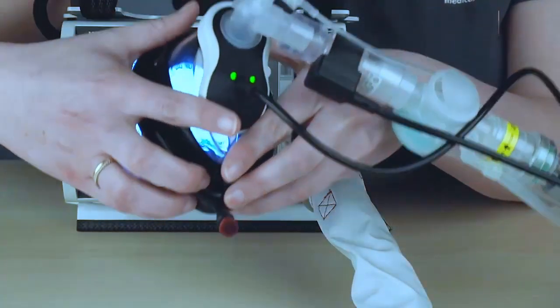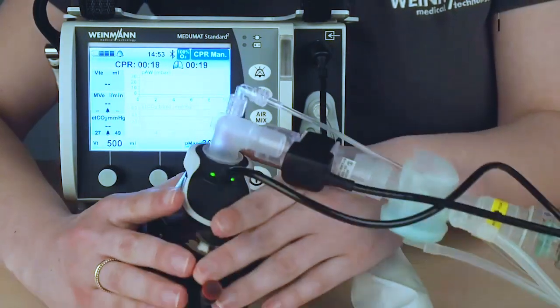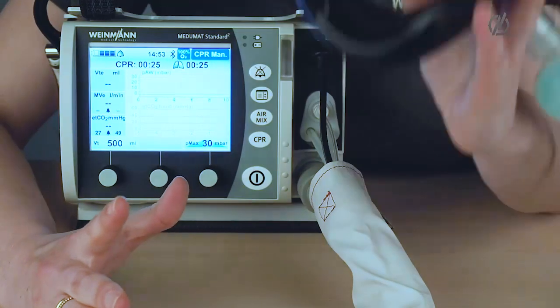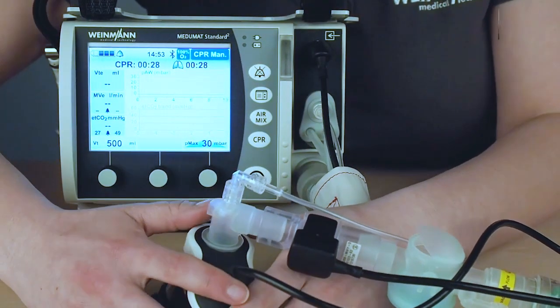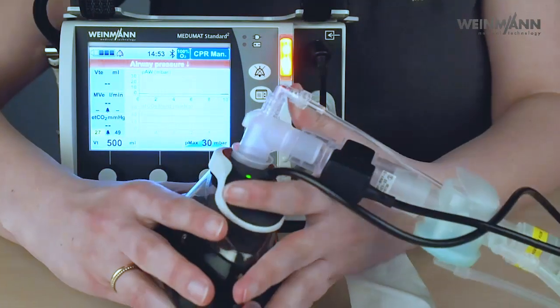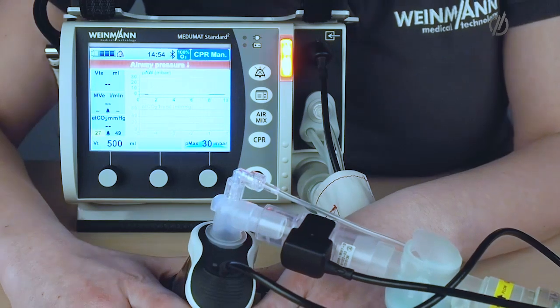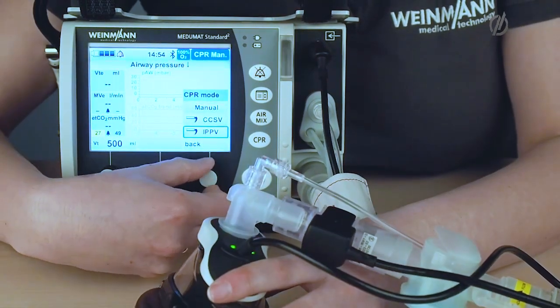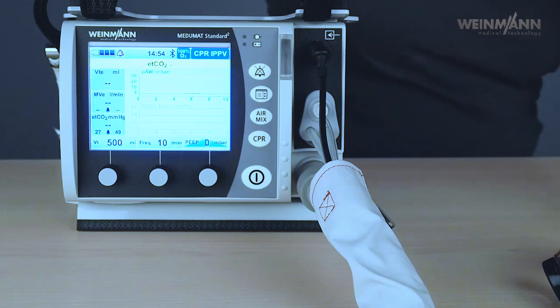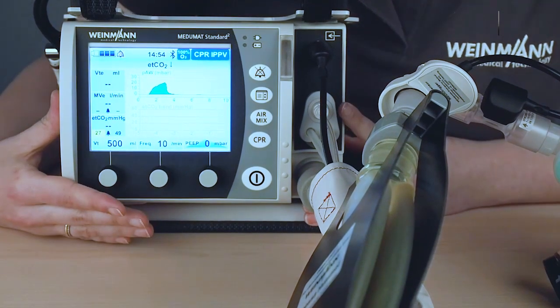So now I have the possibility to use the MEDU trigger, which is a manual ventilation button. So imagine coming to a CPR situation in the CPR mode, the patient is not intubated yet, you use the mask ventilation. So via the MEDU trigger, I can give 2 mechanical breaths while tightening the mask here. After the patient is intubated and the airway is secure, I can go to a standard mechanical ventilation here, where the patient is automatically ventilated. And this is basically the CPR mode.